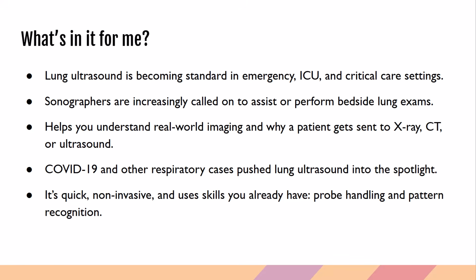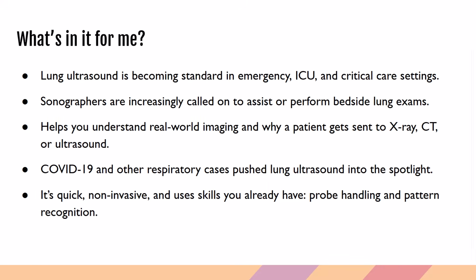But it is here to stay, and as a sonographer, your skills in probe control and pattern recognition give you a head start. Understanding what you're looking at and how it compares to other modalities like X-ray and CT also helps you connect the dots when you get a lung scan or see a patient headed for imaging. It's not just a new skill, it is one that builds on what you already do well.